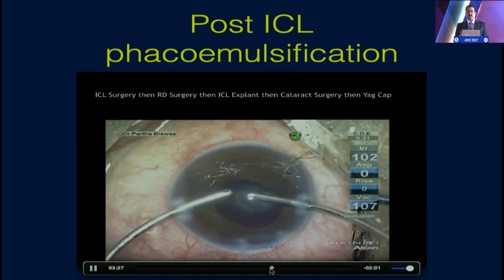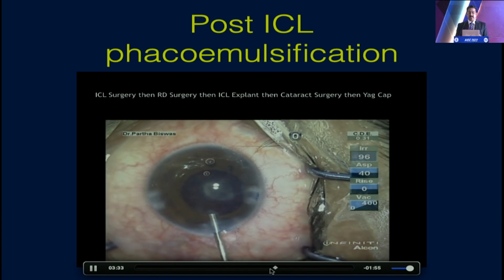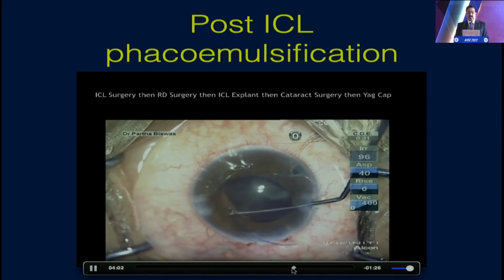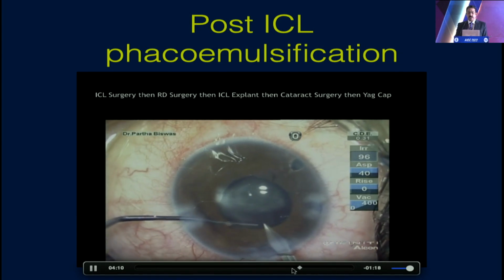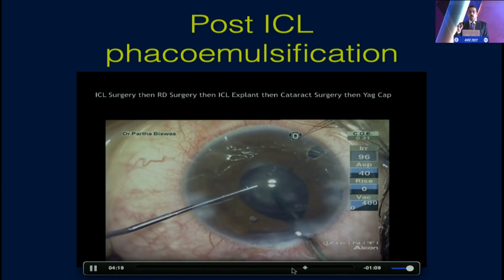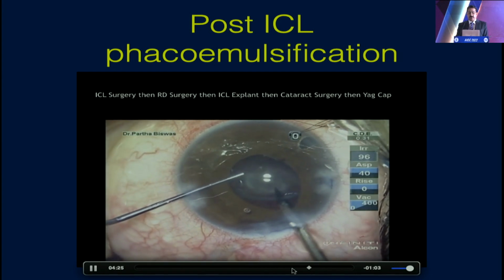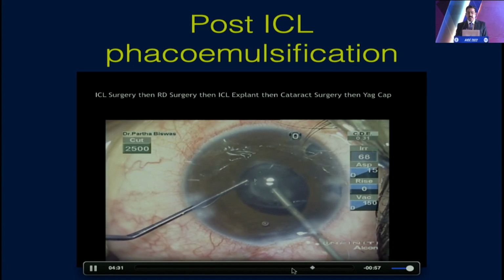And why did this intumescent cataract occur in the first place? There was a lens touch by my retina colleague, and that is the reason why it had occurred. You can see the plaque sitting over there. So we placed in a 3-piece lens in this patient. We do not know whether it went into the sulcus or half into the sulcus and half into the bag. But then what we had to do is to do an opening in that plaque. And it's very important to limit the opening in the plaque, and we did it with the MVR blade going in, and then with the vitrector carving out a small area through which the visual axis could be assessed.